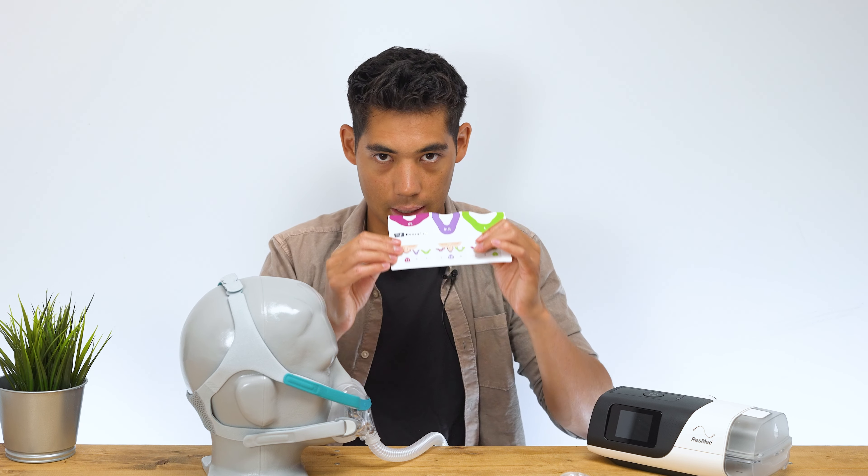The exhalation ports are perforated rather than a single hole at the top, so your exhaled air diffuses a little bit — which is good. You don't want to be shooting your partner in the face with a single jet stream of air. Putting it back together is easy — just the reverse. Overall the breakdown is pretty simple; you're doing it once a week for cleaning, and it's straightforward.